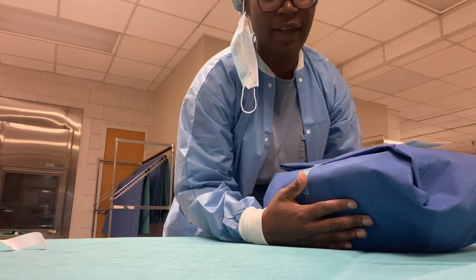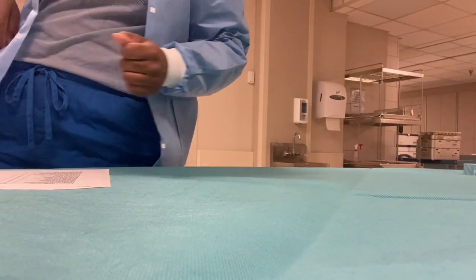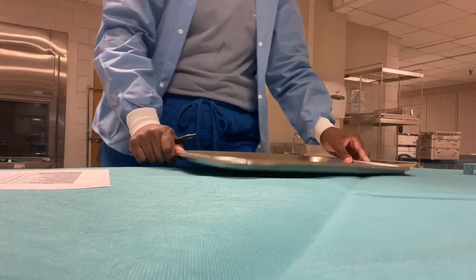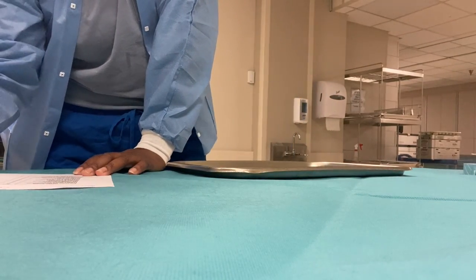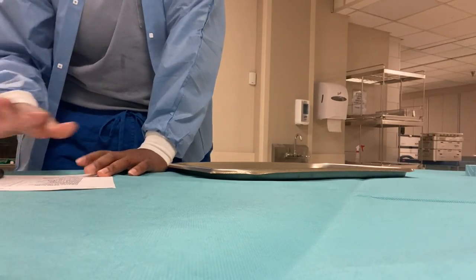And next we have the C-section. So now we're doing the C-section. And I'm gonna get that number right there, put it on my paper. Today's date. Initials, I always do that first.